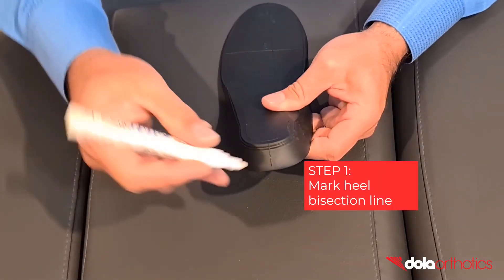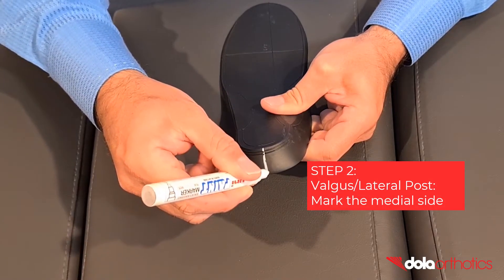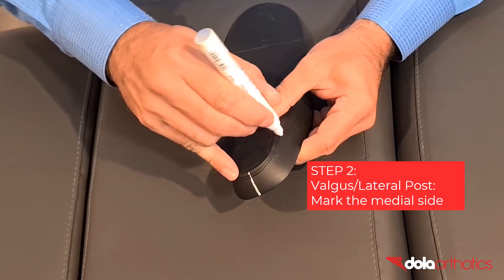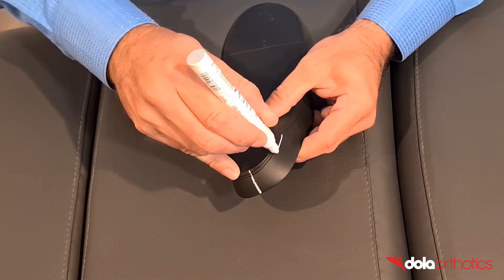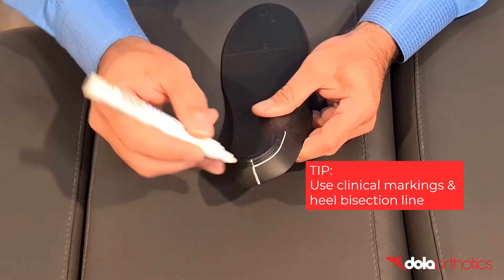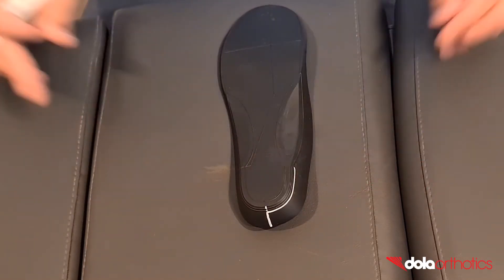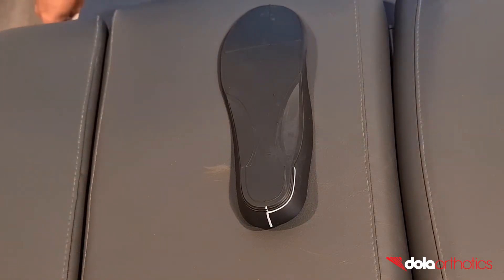Step 1: Mark the heel bisection line. Step 2: For a valgus or lateral rear foot post, mark a point or line on the medial surface of the heel cup. Use the mild or moderate clinical markings, or use a tractograph to measure and mark your required angle. You now have your angle marked as a guideline for grinding.